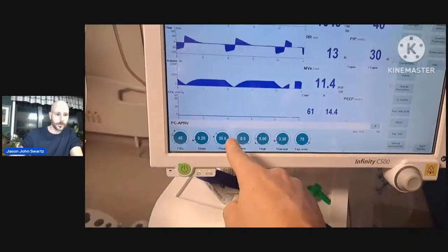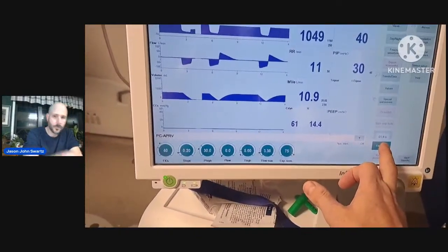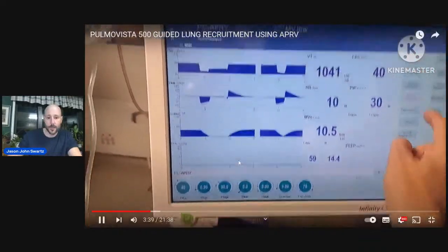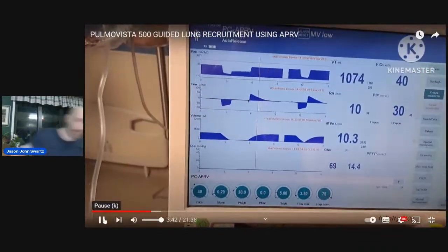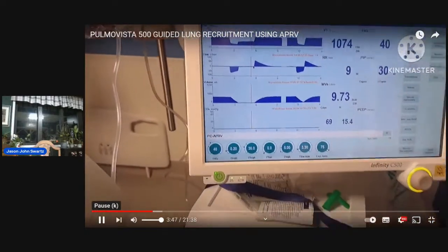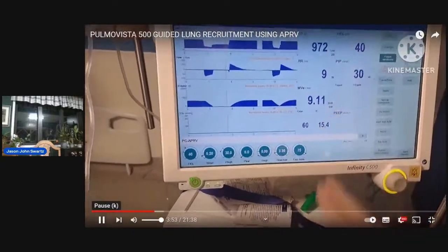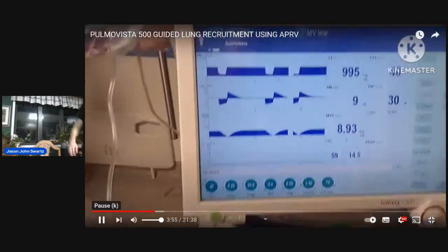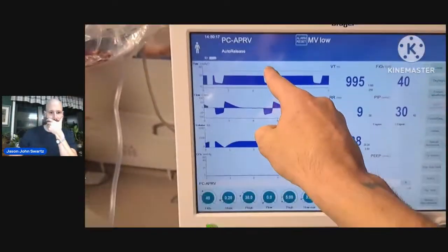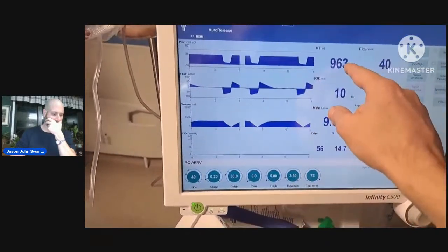To 30. The releases, expiratory termination. So you see it's at 0 here. There, so it's 15. So the P high is 30 and it's dropping to 15 as a P low. So there's a delta of 15. Understand that the volume here is all of the lung recruitment over 5 seconds. This is a passive release, okay? A passive release, and it's measuring that.